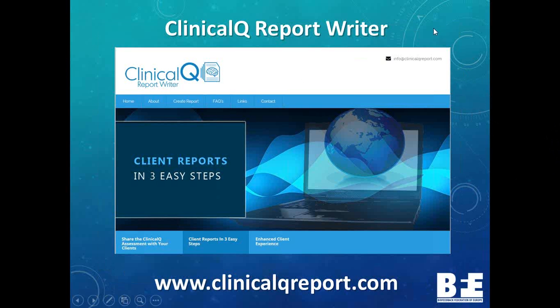So the ClinicalQ Report Writer was a solution where we can take the results that you get by following Dr. Swingle's ClinicalQ assessment. The report writer analyzes the numbers and presents back a really easy to read client report that you as a clinician or health practitioner can read yourself. It explains in simple words what the results are, and it's a report you can hand to your client immediately, so they understand what the assessment was, what statistics we looked at, what the result is, and how that's interpreted into their normal life.